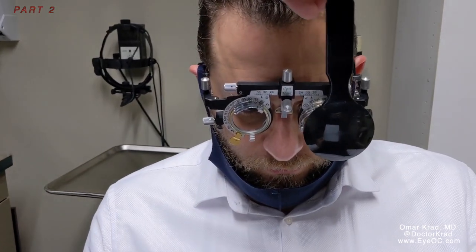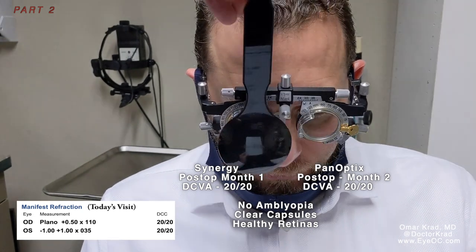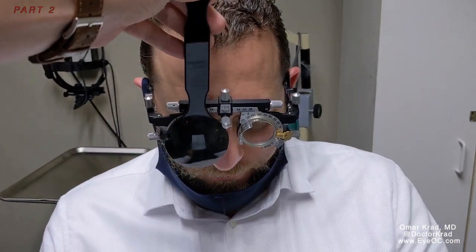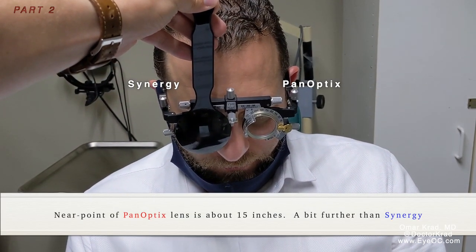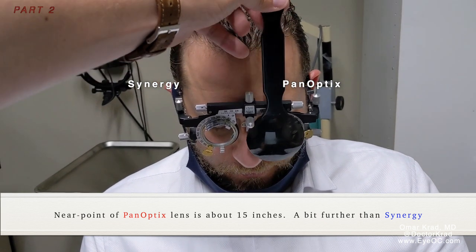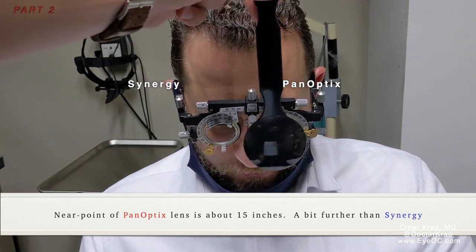Is this the Synergy eye or the Panoptix eye? This is the right Synergy, or do you like the left Panoptix? The right is slightly better. Now I want you to push the card out further until it gets as clear as possible with your left eye. Maybe an inch further. How do you compare the right with the left? Left is better now — the left is a little bit better.